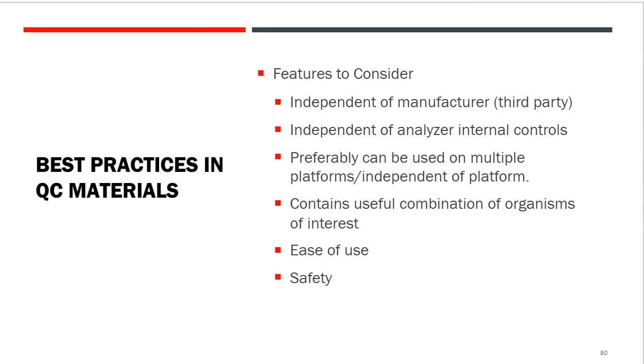Best practices in materials, as many of these are recommended by the 15189 standard, as well as just general good idea. Independent of manufacturer, third party, independent of the analyzer, internal controls, can be used on multiple platforms, independent of platform. This, by the way, is also a mechanism for inventory management. If you have one control that works on several platforms, that's a lot easier to manage and can often get you volume discounts to improve the cost issues. Useful combinations of organisms, ease of use, safety, all sorts of good things here.